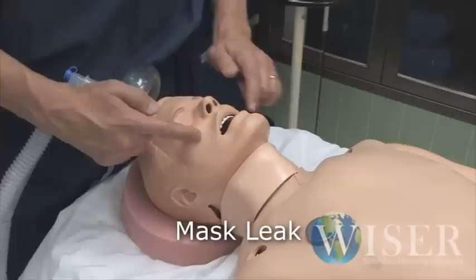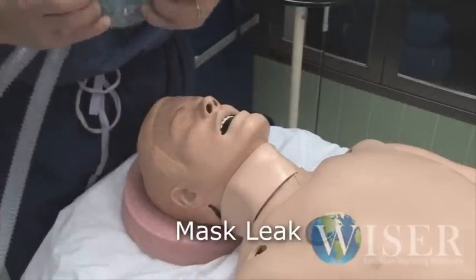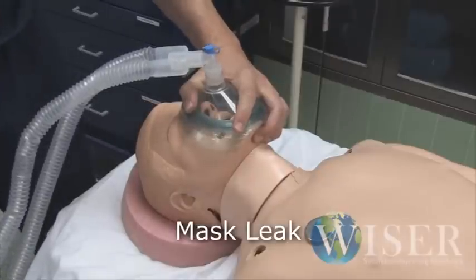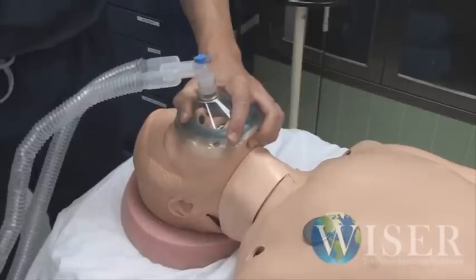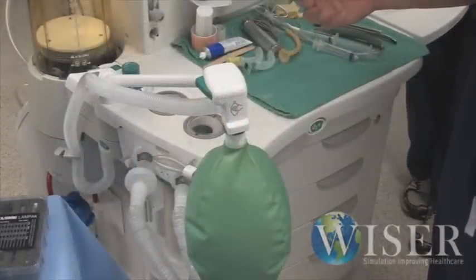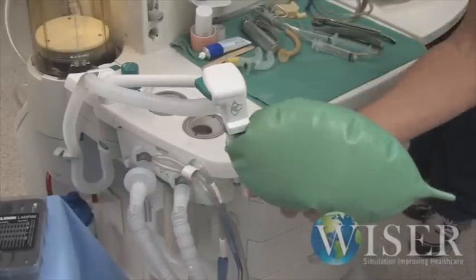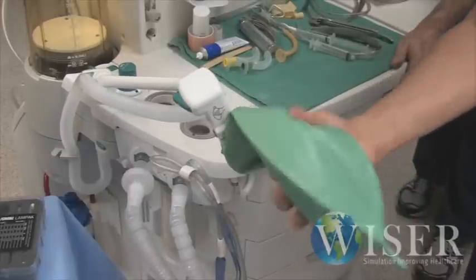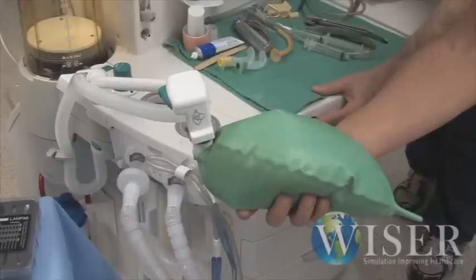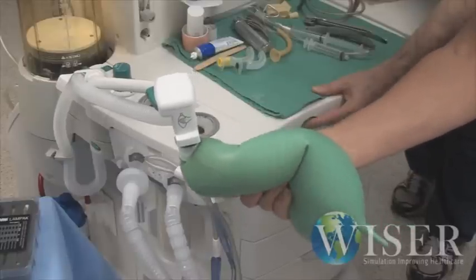The other thing is that the mask doesn't seal very well around his face, so you're very likely to get a mask leak. As you ventilate the mannequin, some suggestions are to splay out the mask, start at the tip of the bridge of his nose and roll it down around his face, and then hold it as you would any other face mask. You've got to squeeze really hard to get his chest to go up and down. What we'll often do is have a simulation cohort slip in behind you and hit the flush valve to keep the bag inflated and make it feel more realistic.